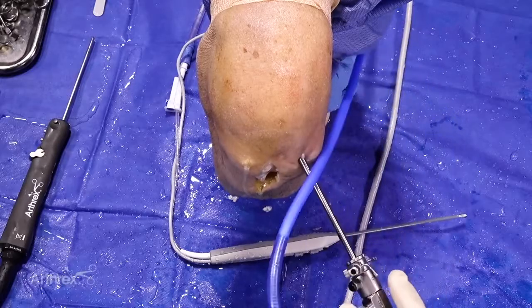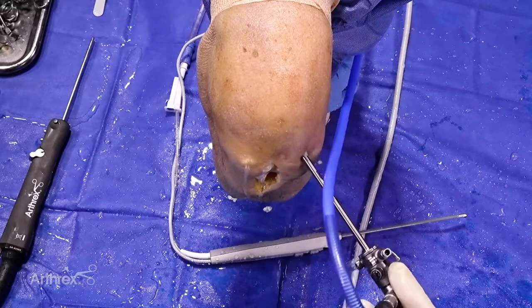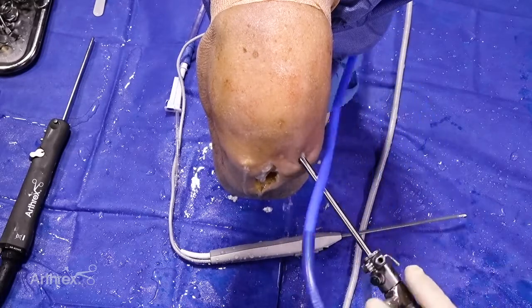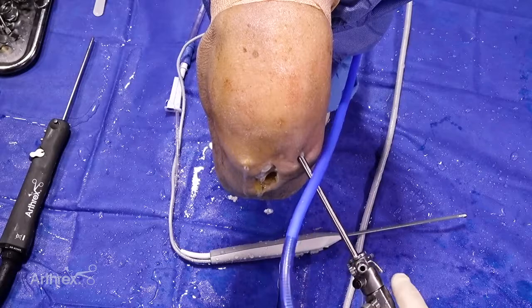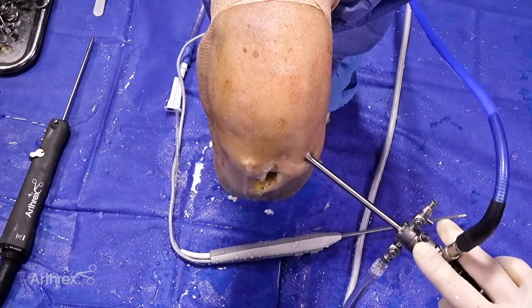Today we are doing an ACL reconstruction with bone patellar tendon bone autograft using the flexible reaming system and the fast thread biocomposite screw on both the femoral and tibial side. This is showcasing the benefits of using the flexible reamer system through a central medial portal on the left knee.